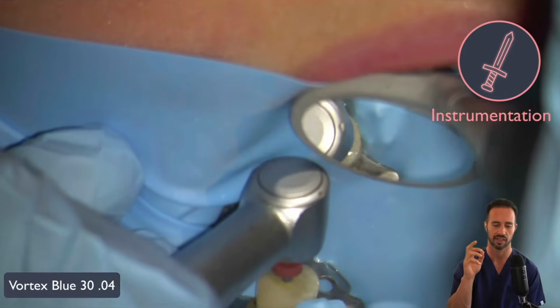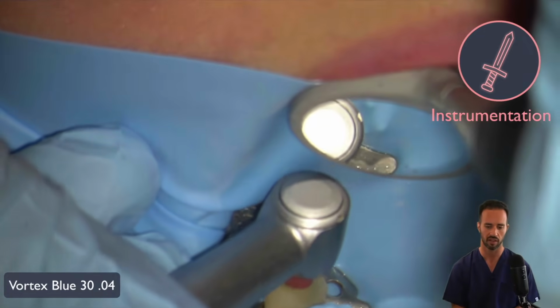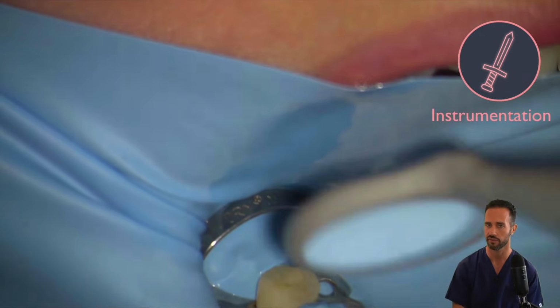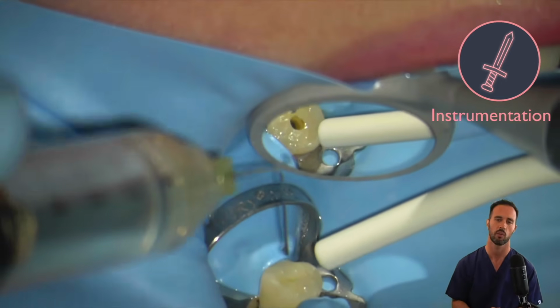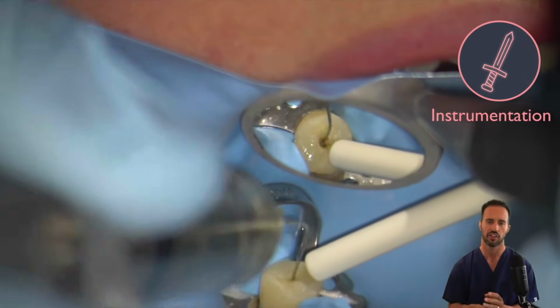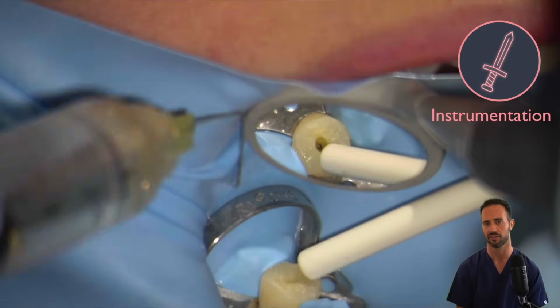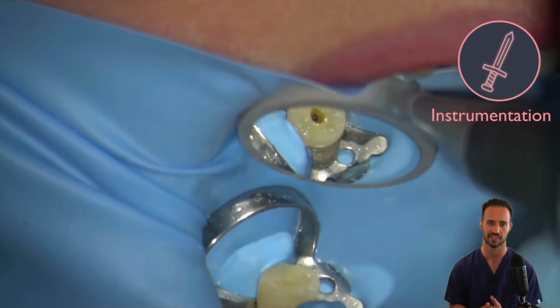So we have our size 30 04 Vortex Blue rotary file, again to 23 millimeters. Every rotary file, other than our orifice opener, goes to length. That would be what I would recommend. But again, more sodium hypochlorite. The cumulative effect of all this sodium hypochlorite is really what's going to make the difference in terms of making sure that your case is fully disinfected.